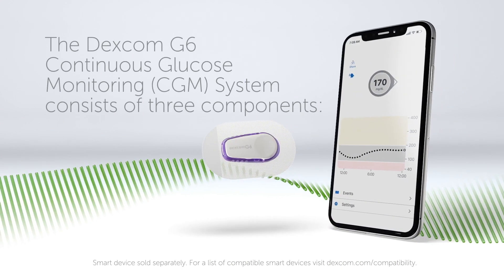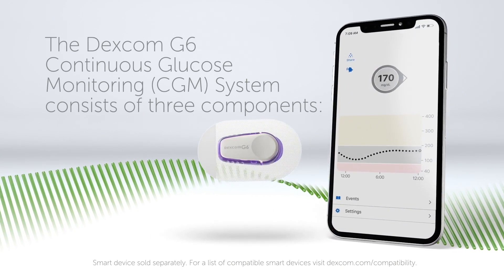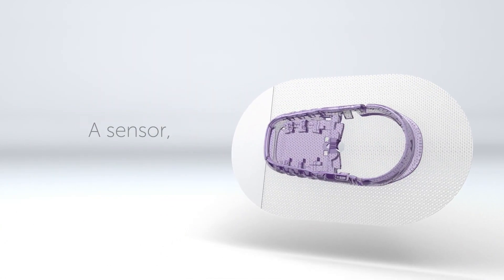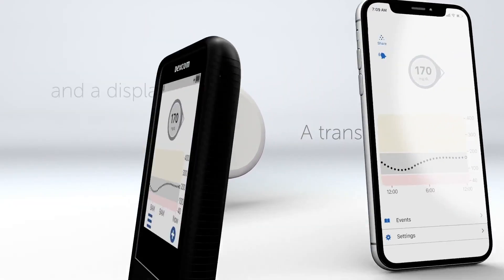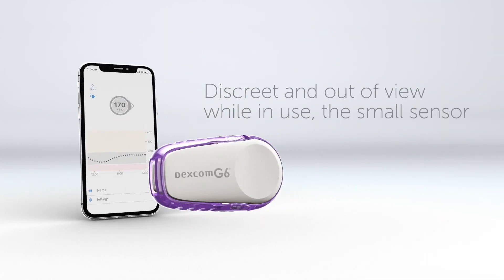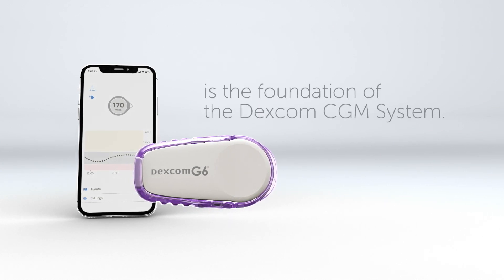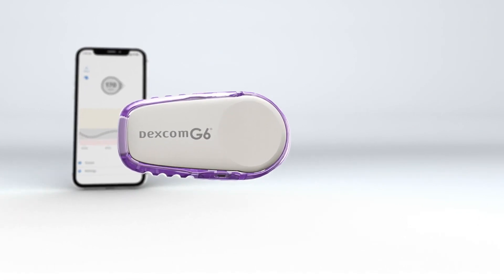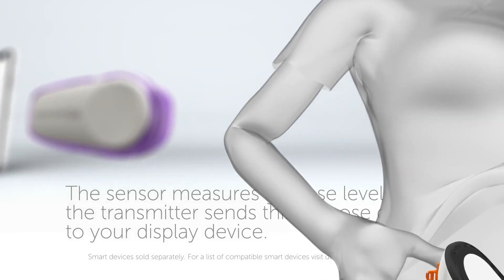The Dexcom G6 Continuous Glucose Monitoring System consists of three components: a sensor, a transmitter, and a display device. Discrete and out of view while in use, the small sensor is the foundation of the Dexcom CGM system. The sensor measures glucose levels, and the transmitter sends this glucose data to your display device.